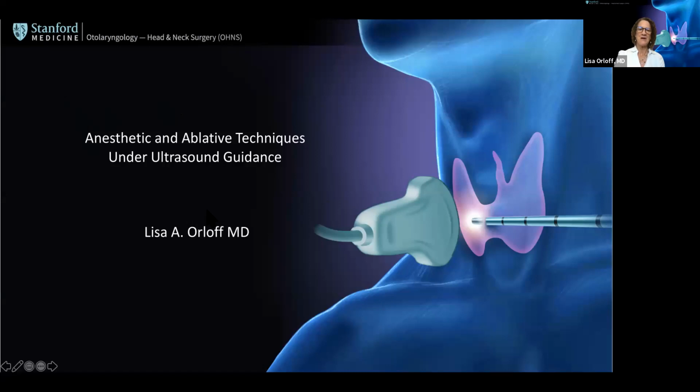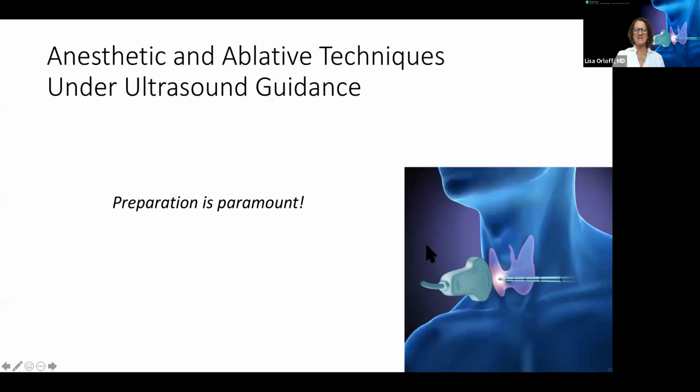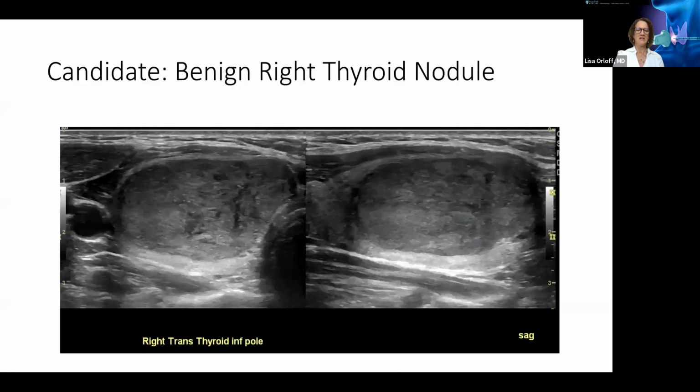So I'm going to talk about anesthetic and ablative techniques under ultrasound guidance. And I can't overstate also that preparation is paramount. Preparation in terms of ultrasonography proficiency and preparation in equipment setup, so that during the procedure things are seamless and comfortable to both the operator and the patient.